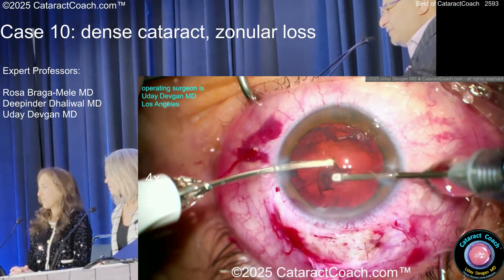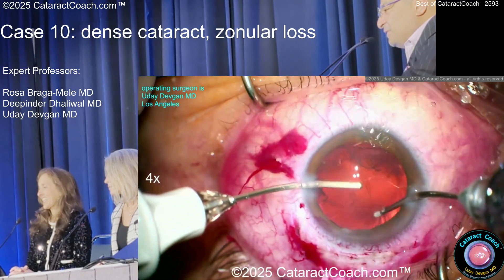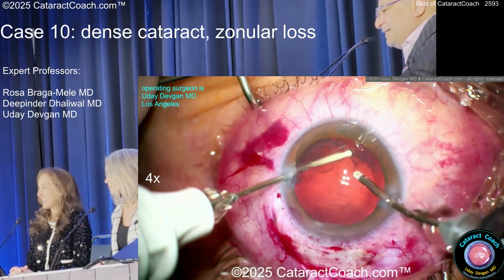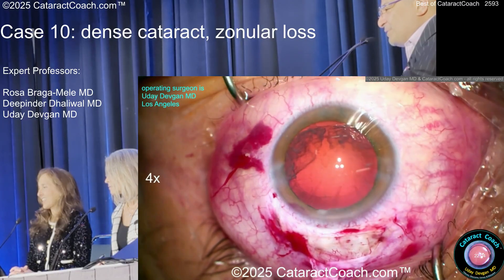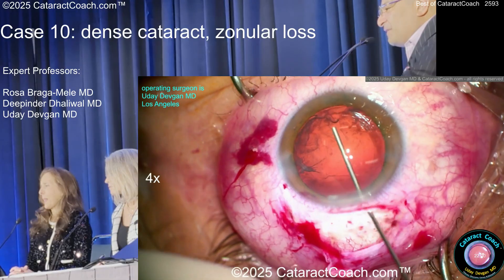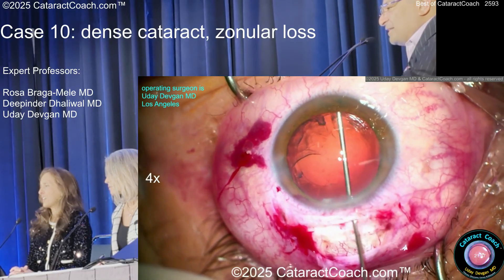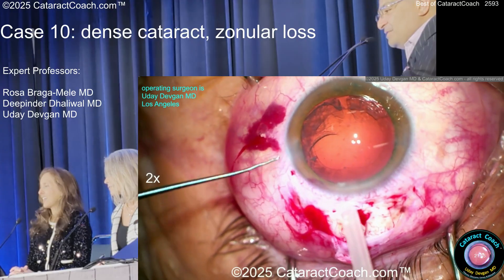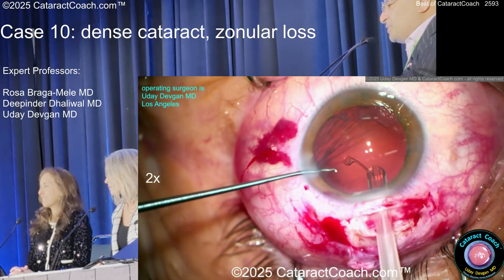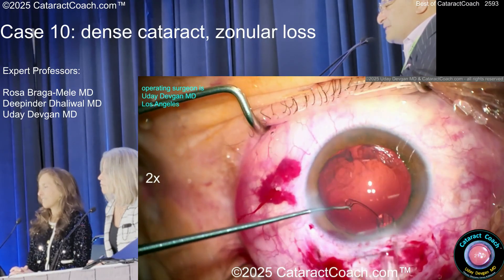The M6 incision just doesn't leak at all during I/A — that's a really neat incision. I think I've finally slightly figured it out. I do the easy areas first and then come to the top. Maybe I should put viscoelastic in first and place the CTR to get more support. There's a little too much of the lens bag equator visible. Here's the CTR going in — I like the Sinskey hook trick.